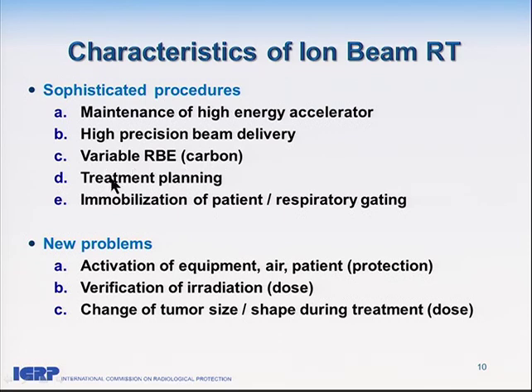Treatment planning is essential in this new technology, actually. And this is a key point, and we need many radiation physics experts. And we have to stabilize the patient, not to move, because in the treatment planning, we target a millimeter resolution of the treatment. It's completely different from conventional radiotherapy, which uses very broad beams. Therefore, immobilization of the patient and also respiratory gating is essential to avoid possible hazard in surrounding tissues.